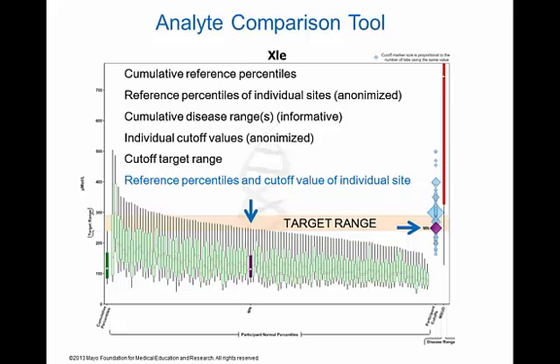The size of a blue or purple diamond is proportional to the number of laboratories that have chosen the same cutoff value. Like all other tools, the Analyte comparison tool is kept instantly up to date after any new data submission and is available on demand.